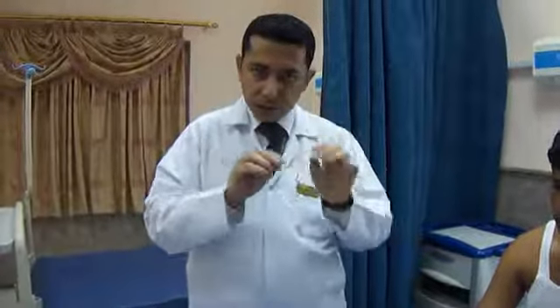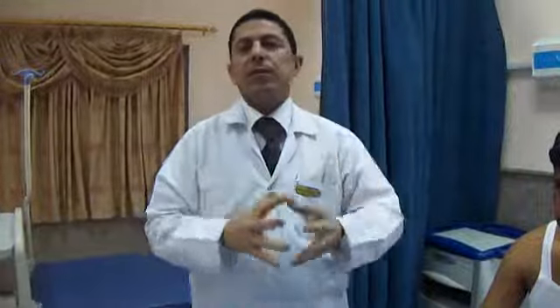We have many methods or ways in which we can measure the body temperature. First of all is the oral temperature. We have external auditory, the forehead, axilla, groin, or even the rectal method. Each way is chosen according to the clinical status of the patient and his age. For example, if the patient is comatose, you cannot check his oral temperature. Instead, you can use his axillary temperature, corrected axillary temperature, or even the rectal temperature.